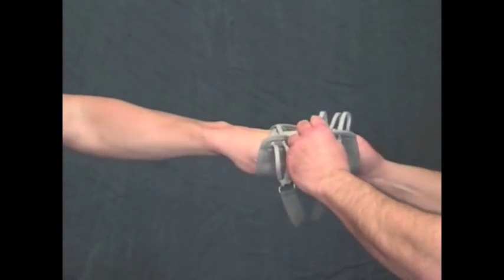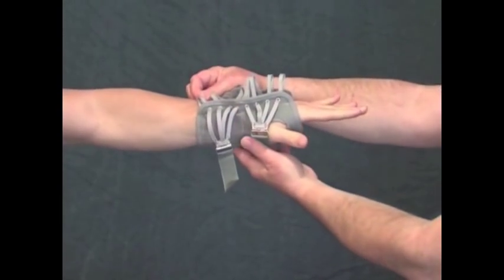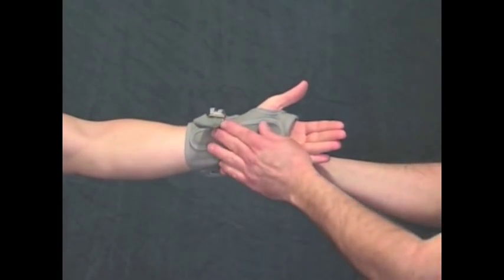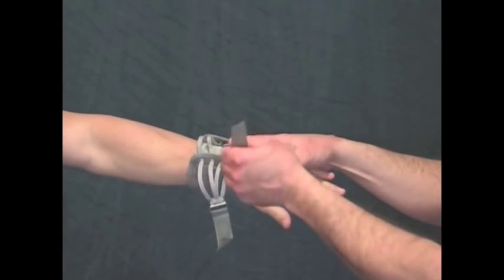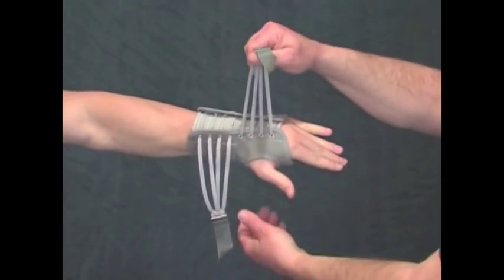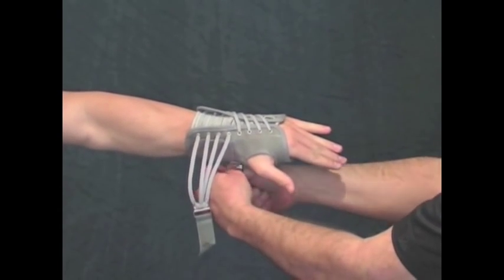Slip the support over the hand and wrist so that the splint is centered over the palm. Position the support as far back on the hand as possible. Make sure the thumb goes through the thumb hole and that the patient has full finger dexterity. If finger motion is compromised, the support is too long for the patient's hand.